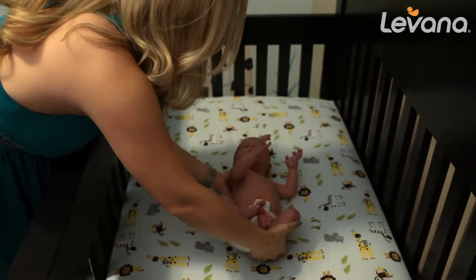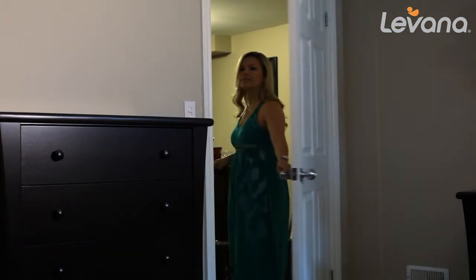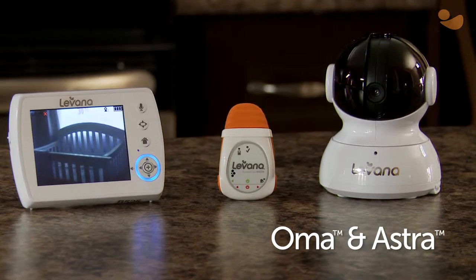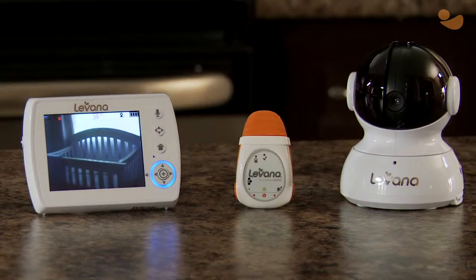We know how tempting it is to check on a soundly sleeping infant over and over again just in case. The Oma clip-on baby movement monitor and Astra baby video monitor alert you the moment baby needs your attention.